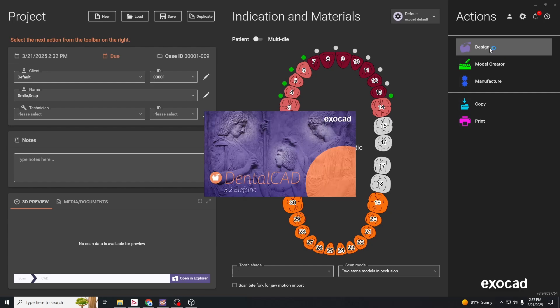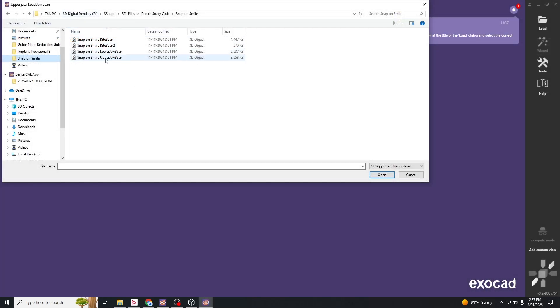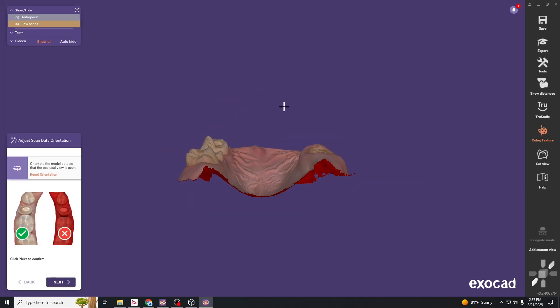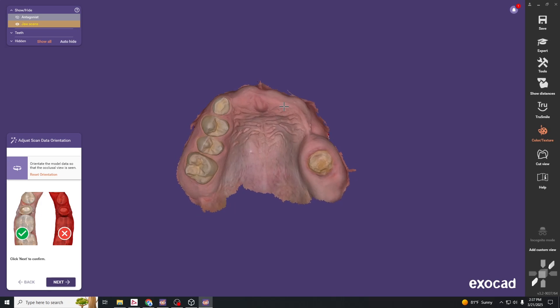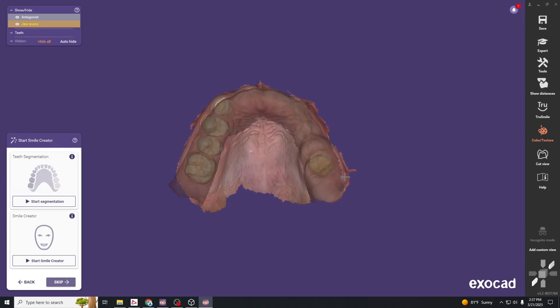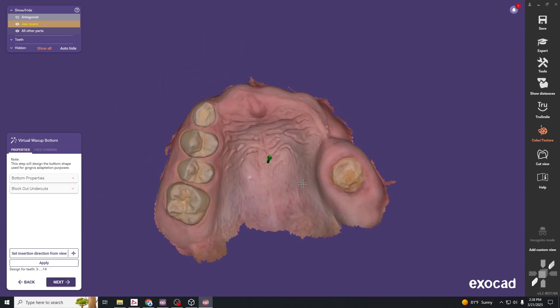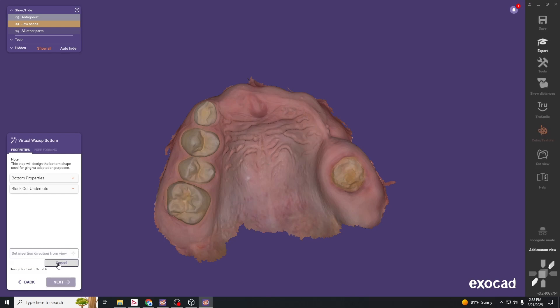Hit design and go ahead and load in your scans — upper scan and lower scan. Adjust the scan so we're looking down the occlusal surface. We'll skip the smile creator, and then we're going to choose the path of insertion of our snap-on smile. Hit set direction from view and apply.